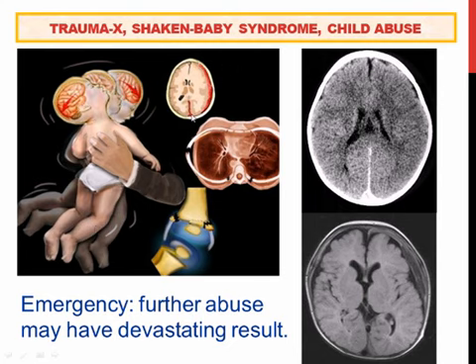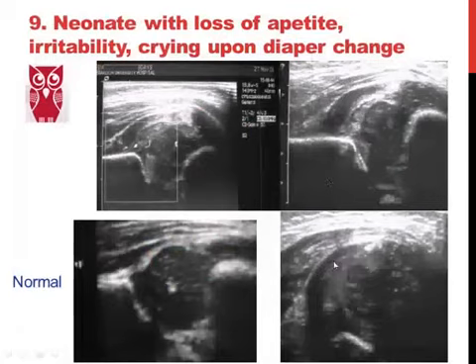But you may have, in a subsequent abusing event, severe central nervous system injuries with subdural hematomas predominating, and the child may end up being severely handicapped, or dead. So you need to protect children by identifying small, hyperdense subdural midline hematomas. Diagnosis is easier when you use a FLAIR MRI with multiple subdural hematomas of different ages.